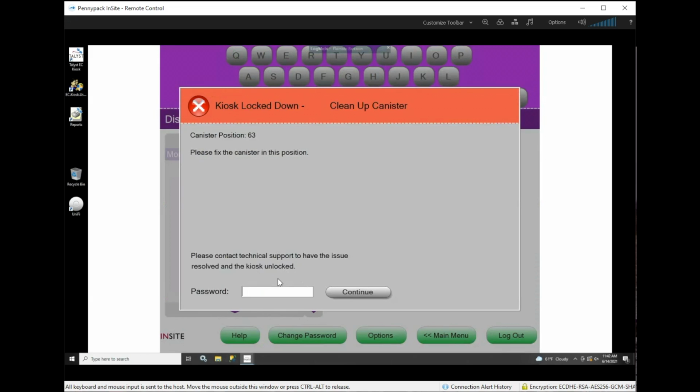So in this case, it's important to not only unjam the canister like I showed you in the previous clip, but to also make sure that you move it to a different base. So if for example, it was in base 53, you want to move it to base 54, just so that in case it wasn't just the canister, it was the base that was the issue, you don't run into the same problem.